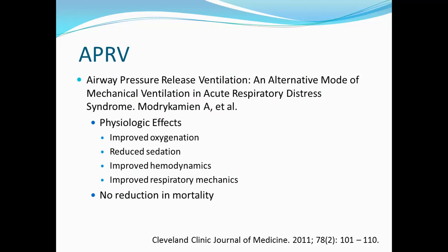This is an article that came from the Cleveland Clinic Journal of Medicine, and they evaluated many different articles that had described APRV, and they feel that the physiologic effects of APRV are that it does improve oxygenation, it does result in a reduction in sedation as opposed to traditional volume assist control ventilation or volume control or pressure control ventilation.